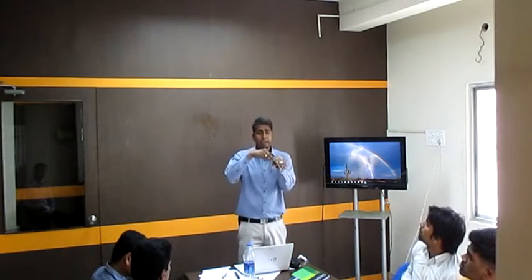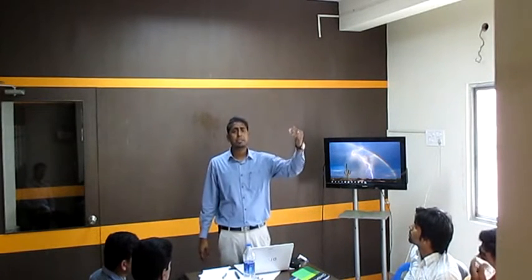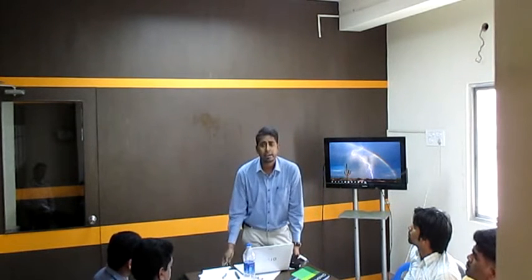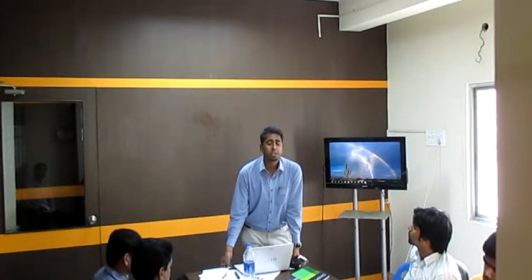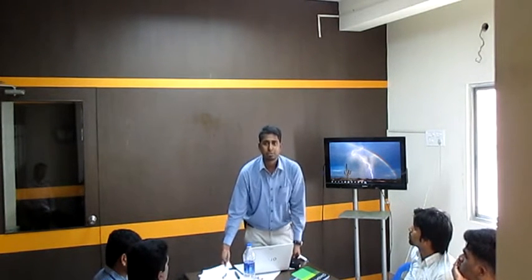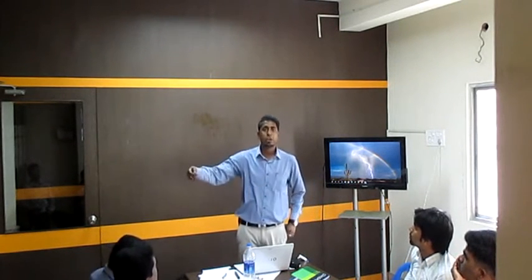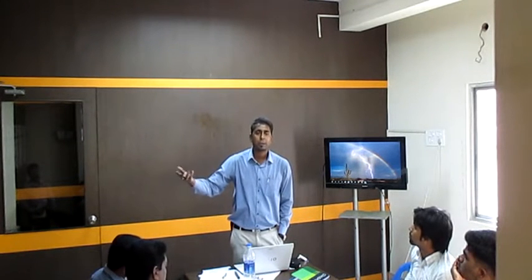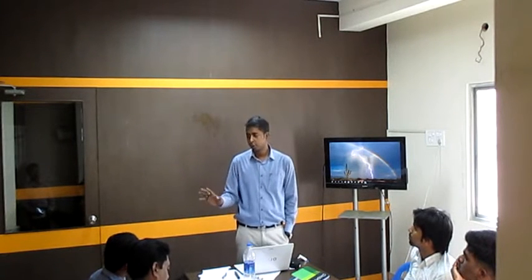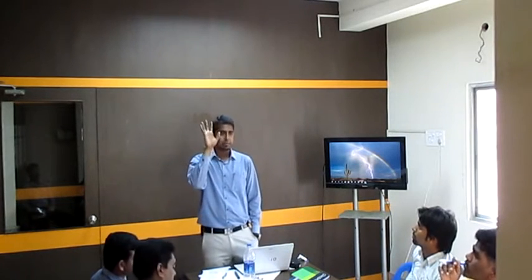So whenever we are operating at any site with our handpiece, we have to keep the temperature of the cutting site lesser than 113 Fahrenheit, so that we do not deliver any unintentional damage to the patient, right? Because we don't want our patient to suffer from pulpitis. If we are not able to control the heat, pulpitis will occur. Pulpitis is nothing but inflammation of your pulp. Got it? So that is why heat is one of the very important parameters.